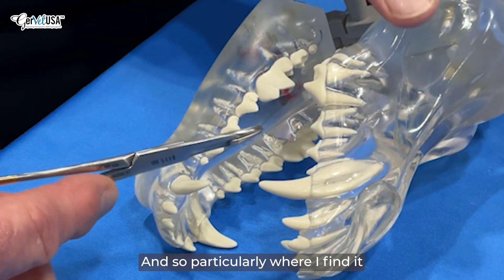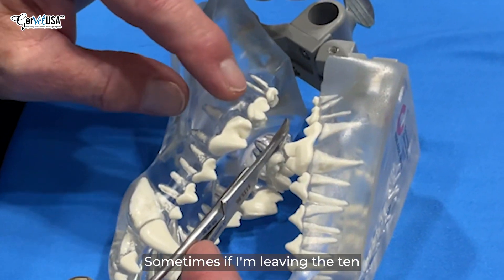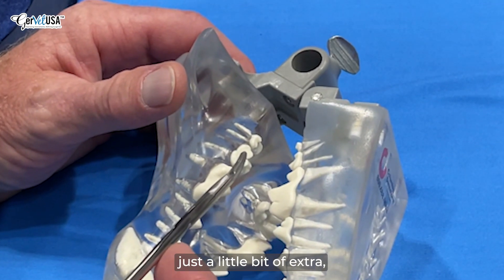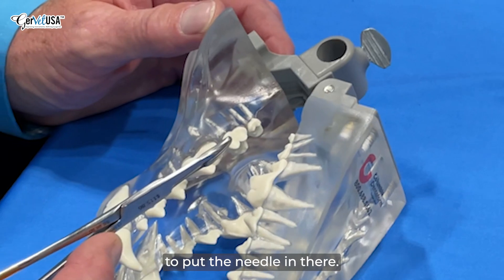Particularly where I find it the most helpful is when I'm working on the upper nines. Sometimes if I'm leaving the 10 and the 8, it's a little bit more difficult to get into that area, and that curve will give you just a better angle to put the needle in there.